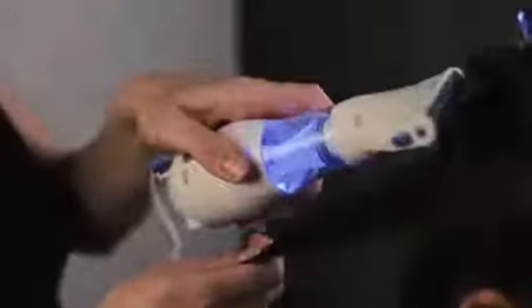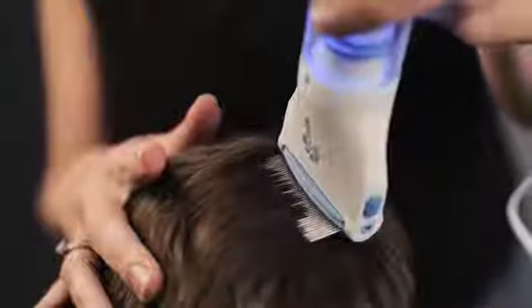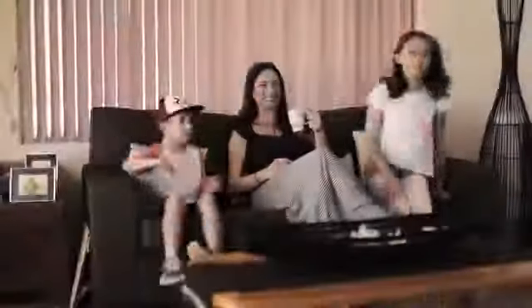Treating head lice infestations has become safer and easier with the V-Comb, combining innovative design and functionality into a simple and easy-to-use product that is a must-have for every home.